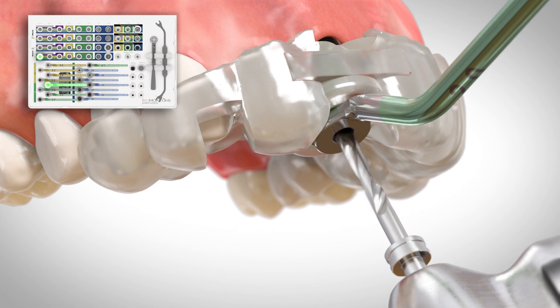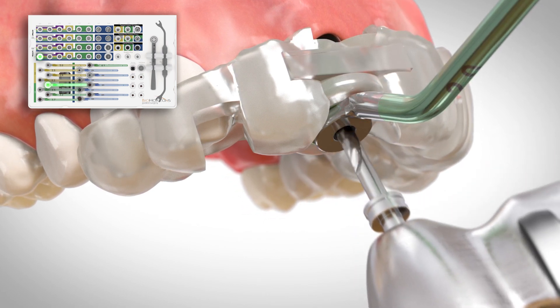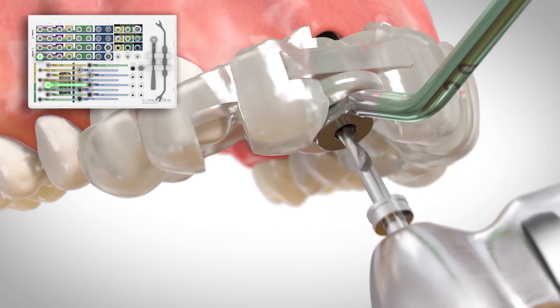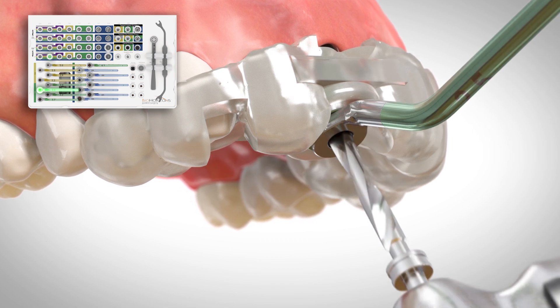Continue to pump the drill in and out of the drill guide to allow for irrigation. Continue to prepare the osteotomy according to the surgical protocol.